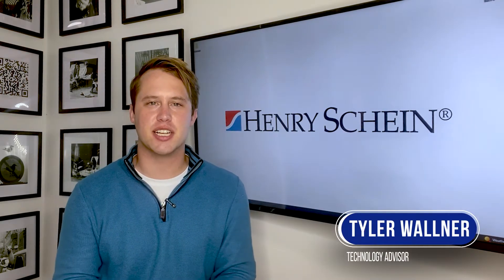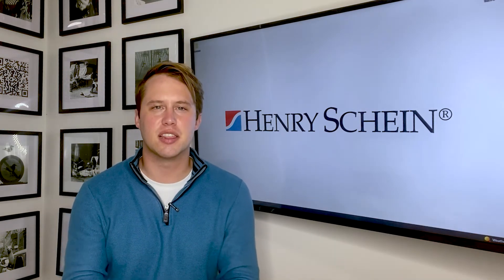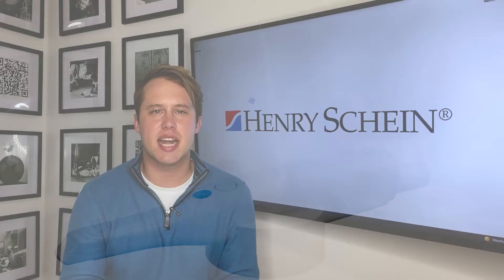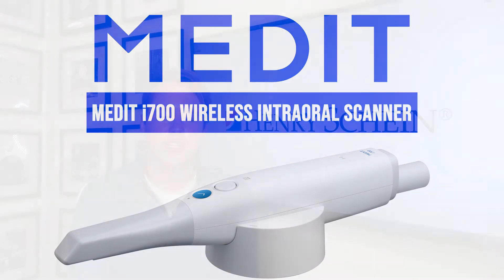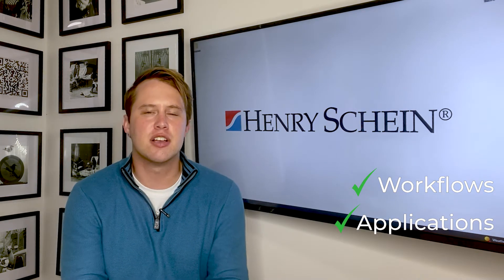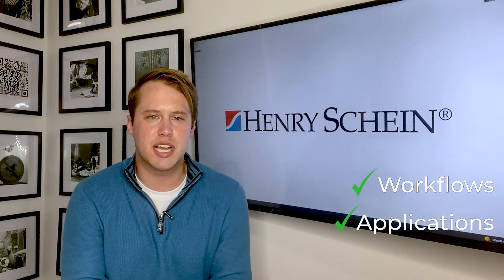Hi, my name is Tyler Wallner. I'm a technology advisor with Henry Schein Dental. In today's video, I'm excited to present to you Medit's latest innovation, the Medit i700 wireless scanner. I'll be walking you through some of the typical workflows and applications of the scanner so you can use it to its fullest potential.